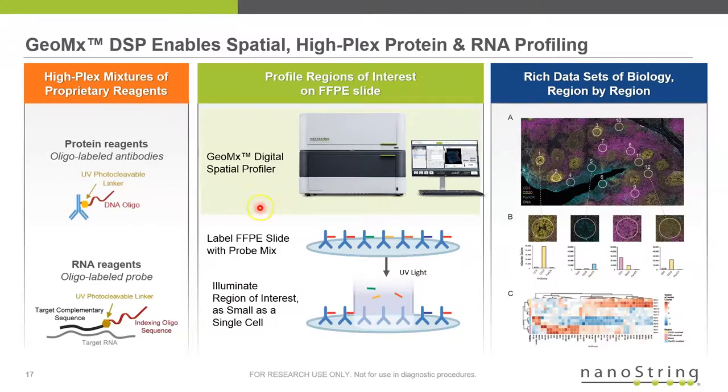So how did we do that? We did that on the GeoMx Digital Spatial Profiler platform. And starting at the left, this is really a combination of reagents, and then the system, essentially the microscope itself, and then data analysis tools.